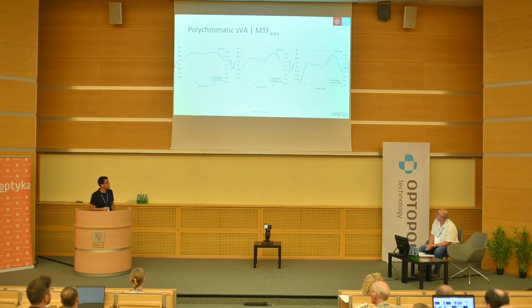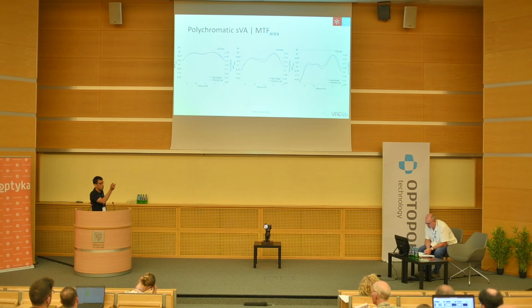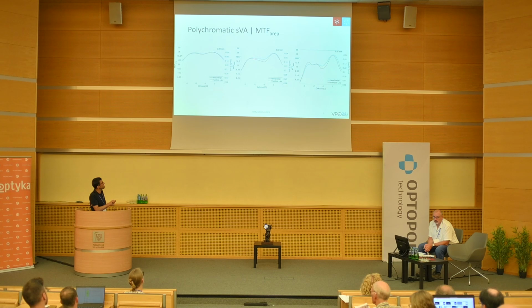As you can see, you end up with a very, very efficient profile that has a larger MTF, a very continuous MTF area, that you can see here, and you can see a conversion from MTF area to visual acuity using a non-linear function. This is from the Sharon papers. You can see the reference in the abstract. And you can see that the predicted visual acuity is a little better here in the intermediate zone for the new design. And for the larger pupil, it was a little bit in here, but you can see that you have a very continuous through focus with this new design.